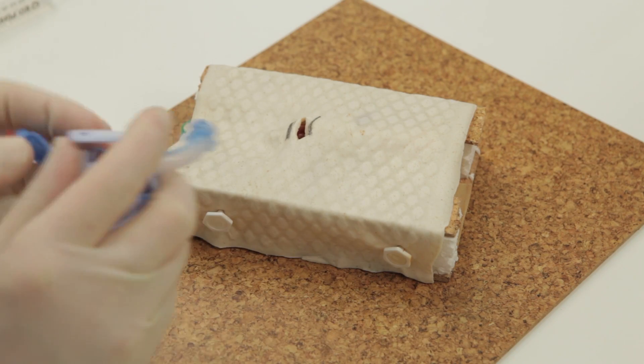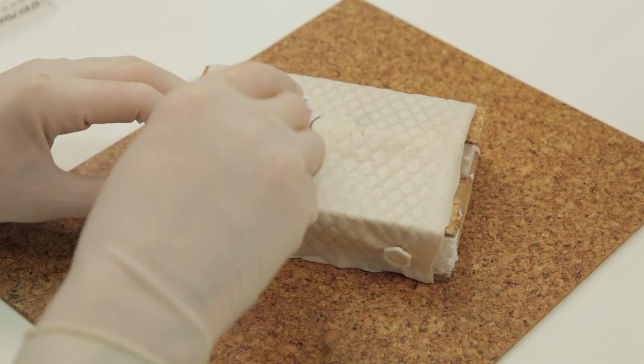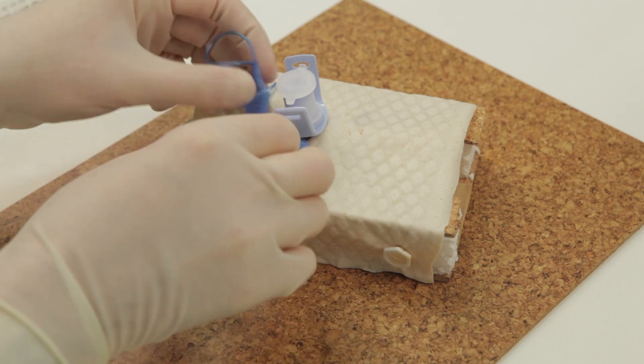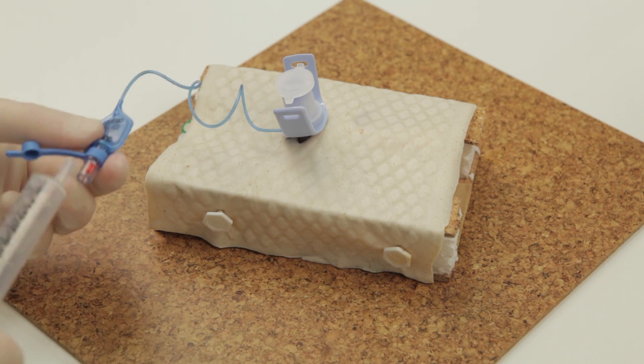The tracheostomy tube should then be inserted as shown. Inflate the cuff, having checked there are no leaks beforehand.